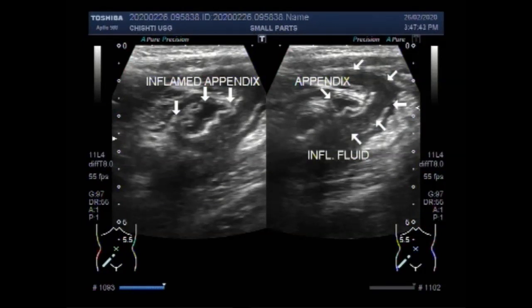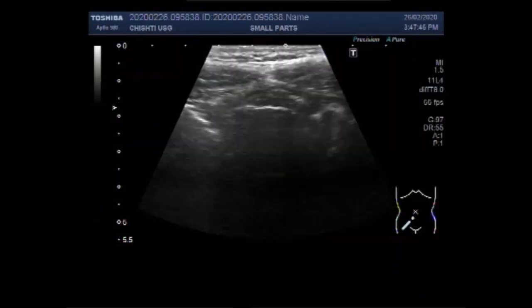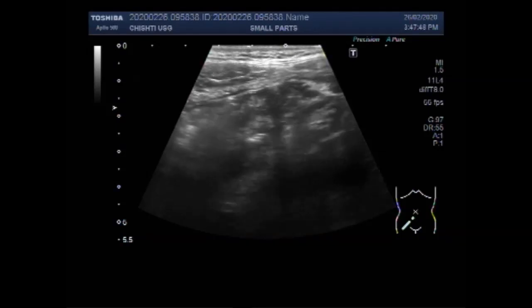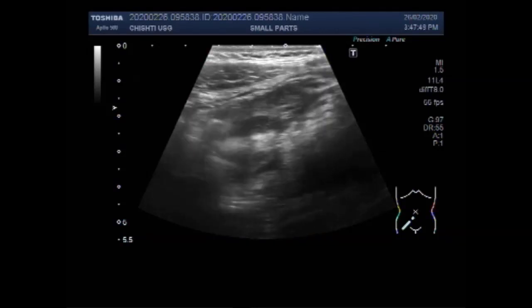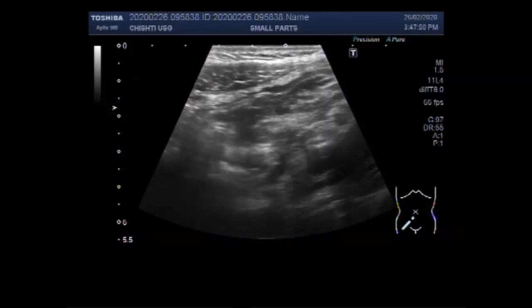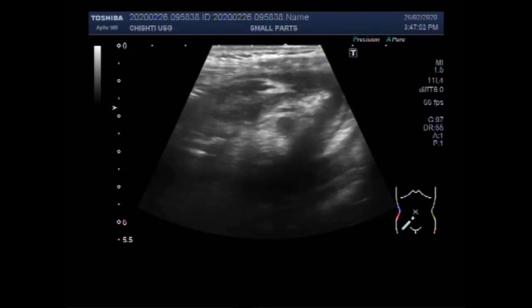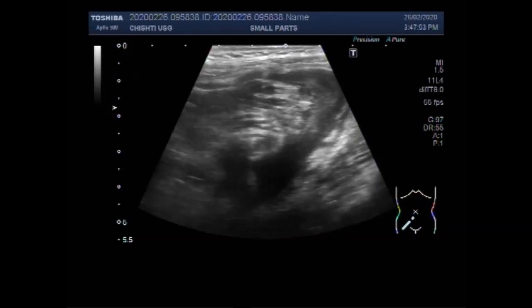Dear viewers, I hope you are all fine. This ultrasound video shows a case of ruptured appendix, leaked appendix.